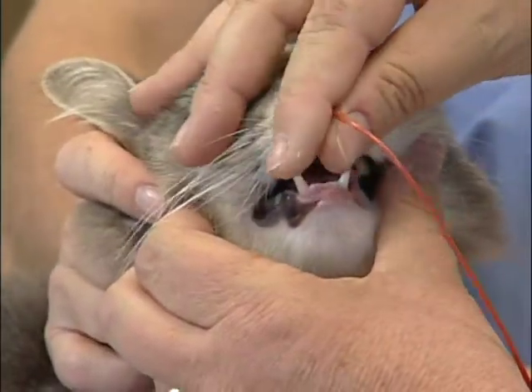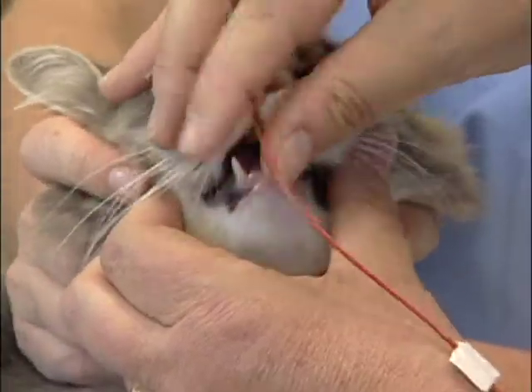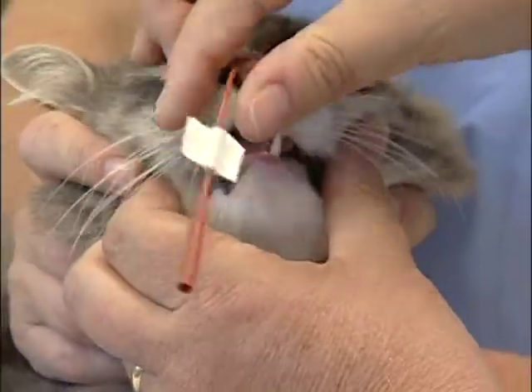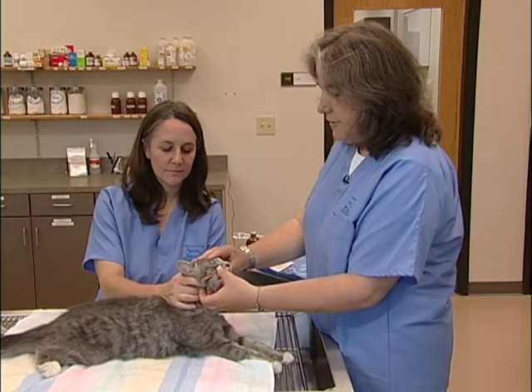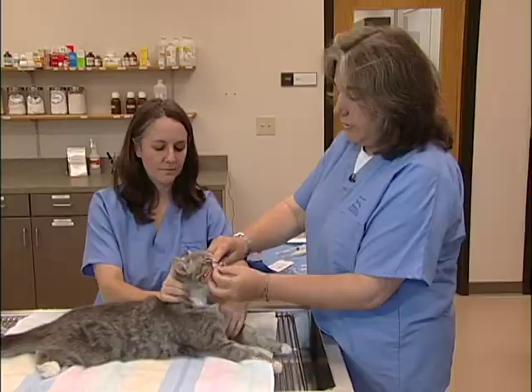The holder should be able to tell me if she feels the kitty swallowing as this tube passes — yes. I'm now going to affix this catheter to the cat's face using a technique that will minimize trauma to the cat.